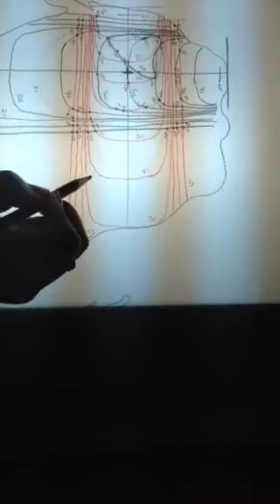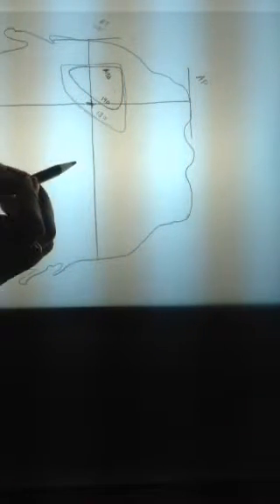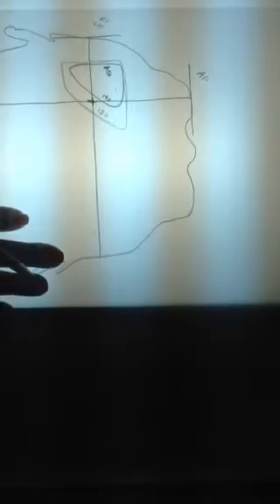There's 35 between 30 and 40. 35 between 30 and 40 here. Do these connect? If they do, I want you to demonstrate those on your final page. So your final page should look like a completed isodose plan. With that, 35% would have been somewhere like this. If you recall what it just looked like when we were doing it, that 35% isodose line would be somewhere like that. Let's overlay it and take a look.